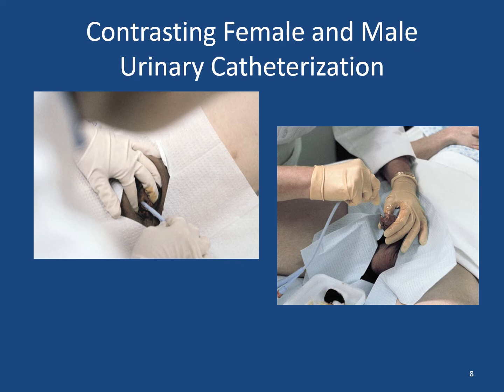Okay, locating the urinary meatus is easier in males and harder in females. You can mistake the clitoris for the meatus in female clients. The penis is held firmly and perpendicular to the bed. The labia on female clients are going to be spread gently but firmly before cleaning and inserting the catheter. Please note, as soon as you place that sterile gloved hand onto the client, you do not move it.